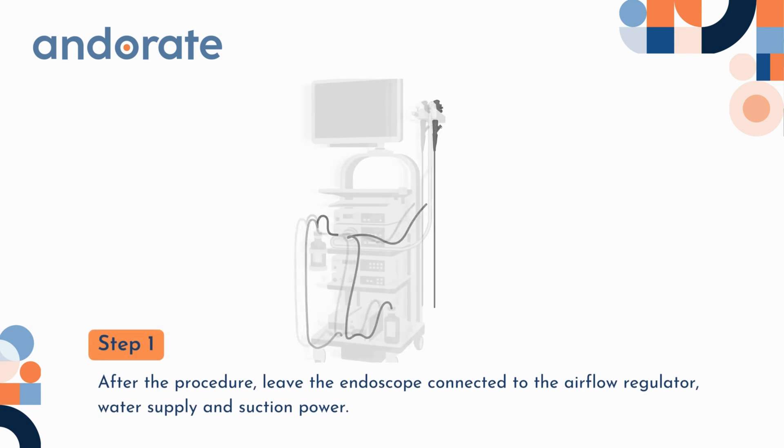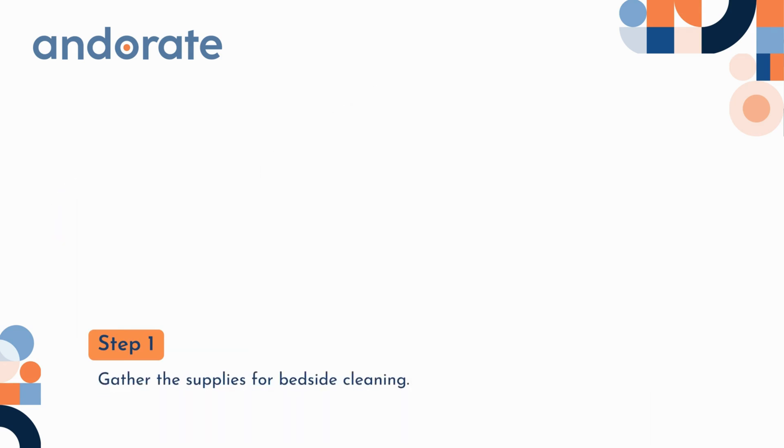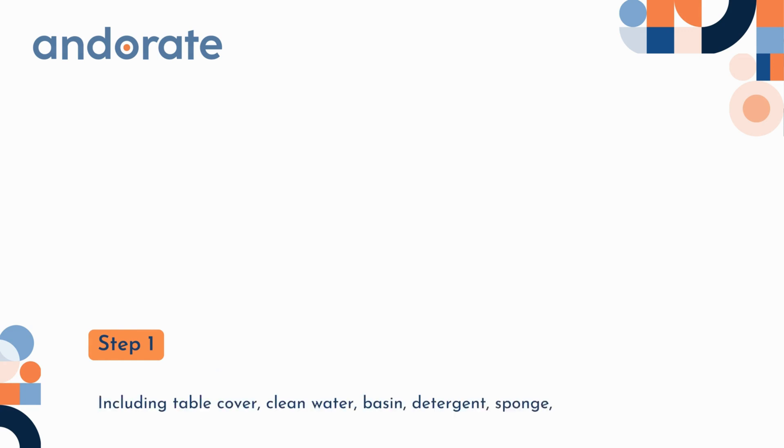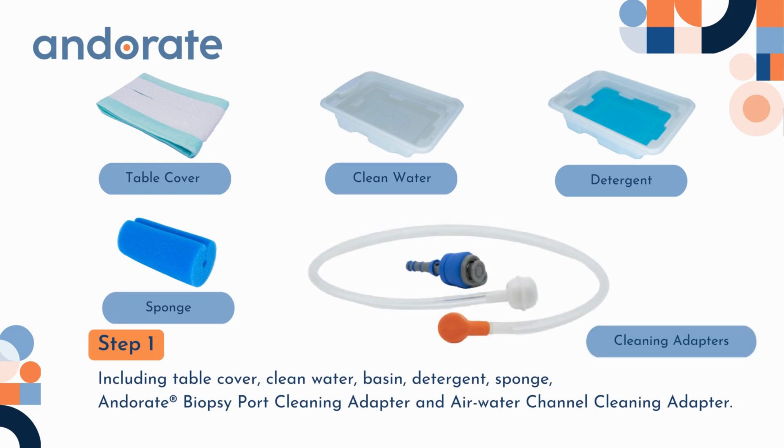Step 1. After the procedure, leave the endoscope connected to the airflow regulator, water supply, and suction power. Gather the supplies for bedside cleaning, including table cover, clean water, basin, detergent, sponge, Andorate biopsy port cleaning adapter, and air water channel cleaning adapter.